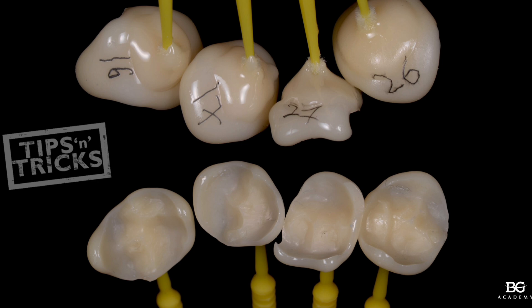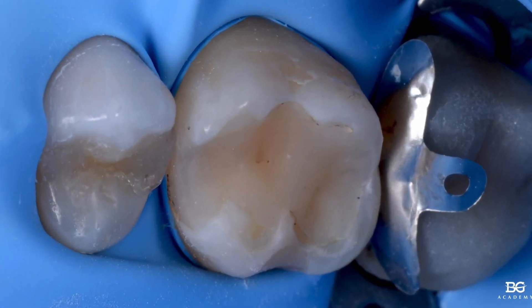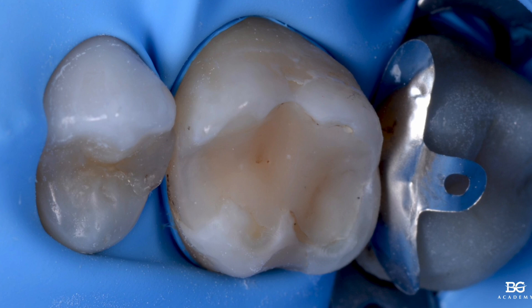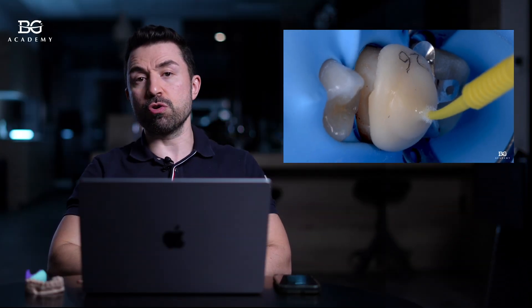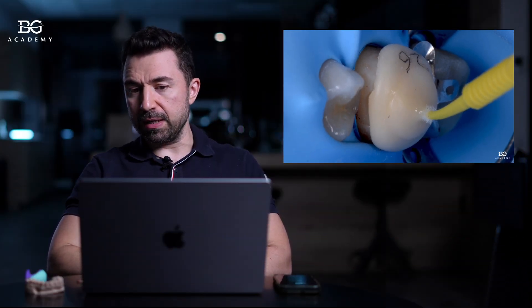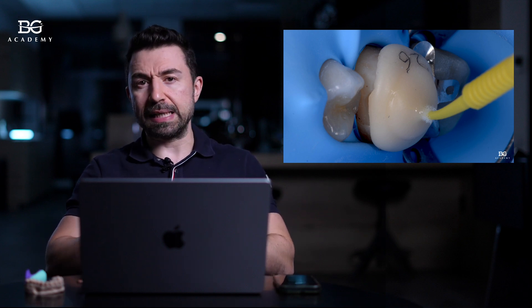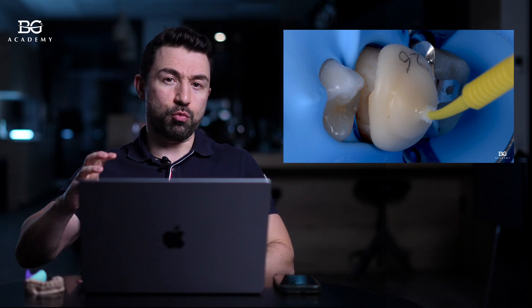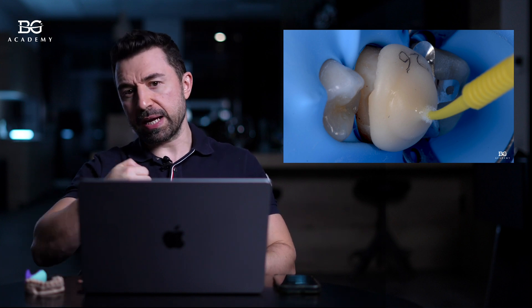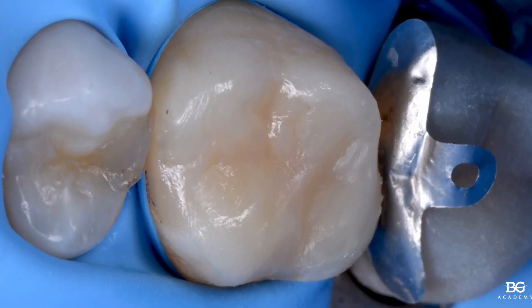Here we have our case isolated. We remove the existing filling, then do some blasting, and the stamp extends to the buccal and lingual sides, giving you support over the patient's tooth. After the bonding and adhesive preparation, when you place your last layer of packable composite, you put Teflon on, then use the stamp — pack it, hold it, press it — then remove it, take off the Teflon, and you get your wax up transferred into the patient's mouth using packable rigid composite in a predictable way.